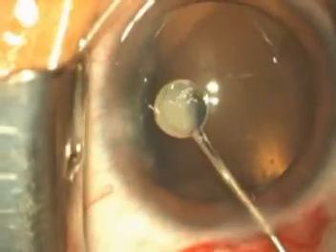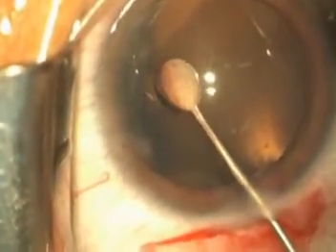A review of the anatomy will demonstrate how the intraocular mirror works. This is the anterior chamber angle, and the arrow indicates the iris root. This is the space between the lens and the iris, the so-called ciliary sulcus. The white line is the capsular rexis margin. The white, worm-like structures are the ciliary processes.